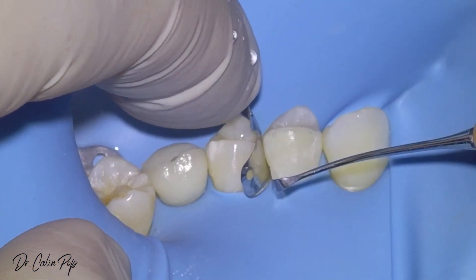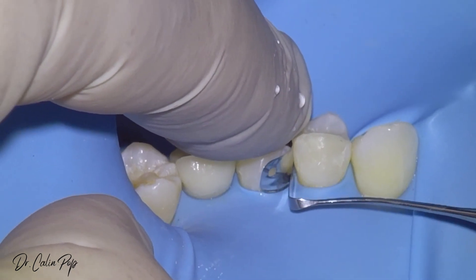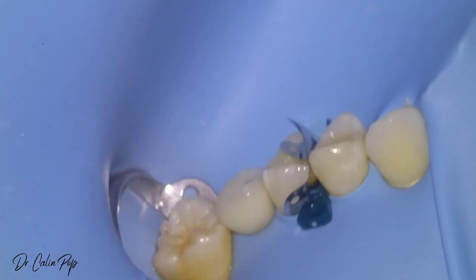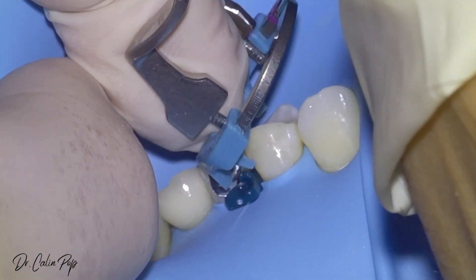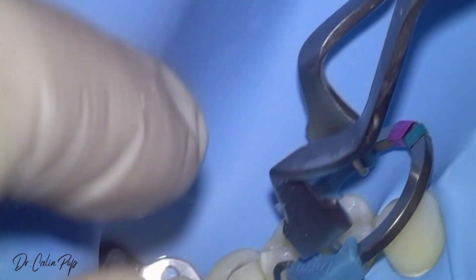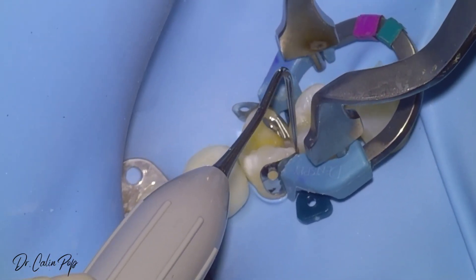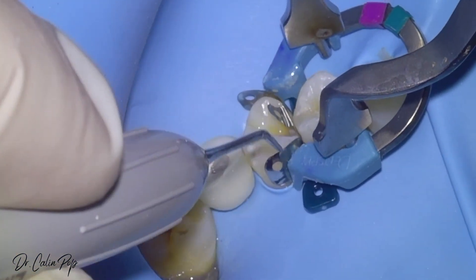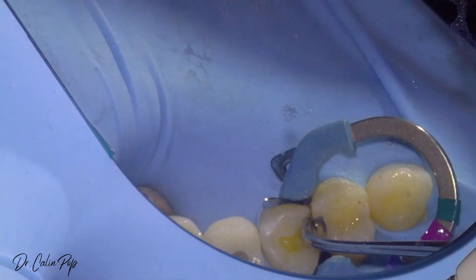Okay, we should go under the rubber. See? He's not over the rubber dam. Always have a look on the other side not to catch the sheet. Pushed too much.